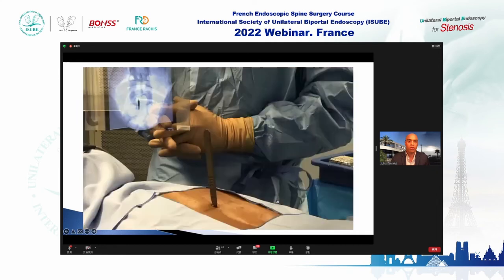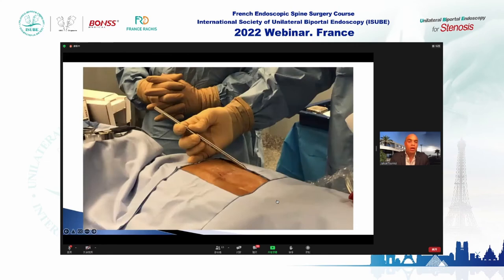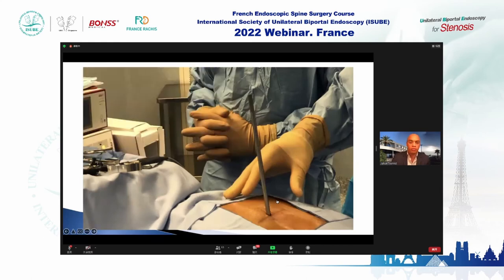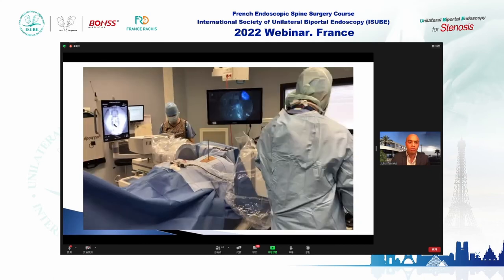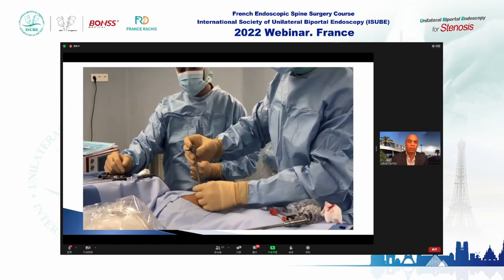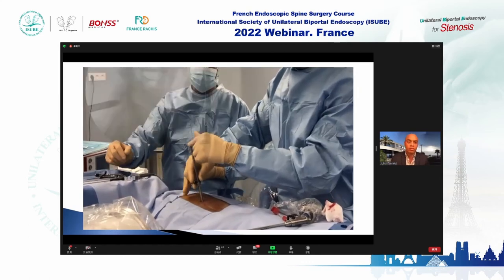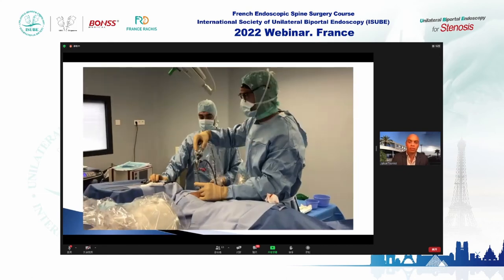In this case, the patient is in prone position. You perform the AP X-ray view, make the incision with the scalpel, enter the dilator under AP X-ray control, then take the lateral X-ray view. You enter the working sleeve and check with a lateral X-ray, then introduce the endoscope.